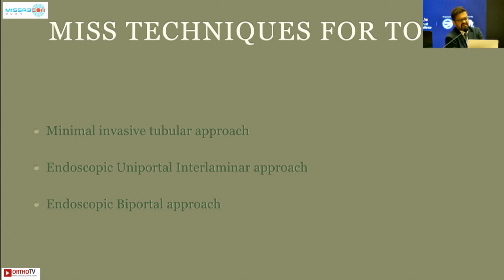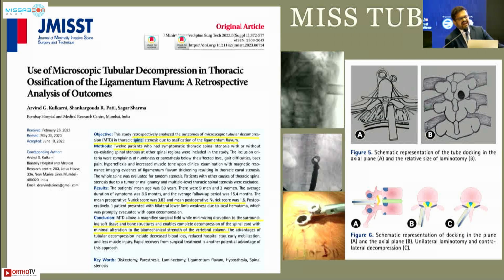There is enough and more evidence to show the safety and efficacy of MIS techniques. This is a publication by Dr. Arvind Kulkarni in February 26, where they have shown the safety and efficacy of microtubular decompression, which causes minimal disruption of soft tissues and the ligamentous complex, hence maintaining the biomechanics of the spine.